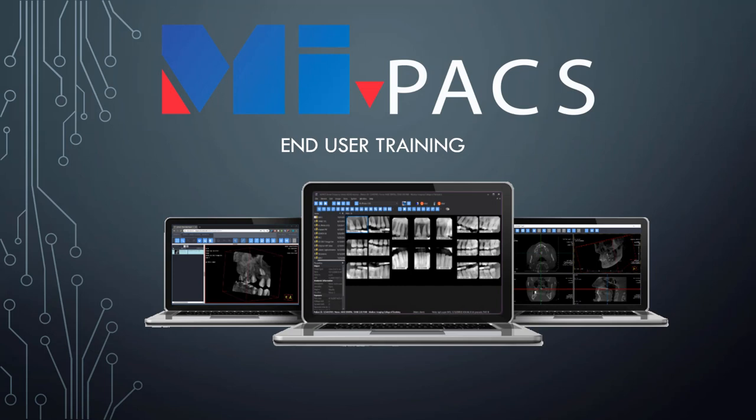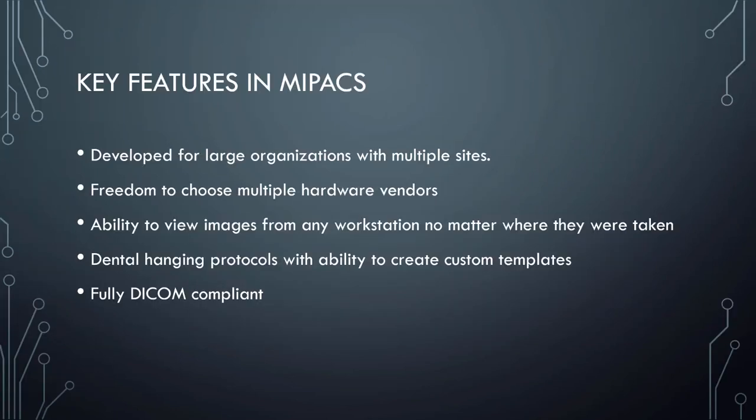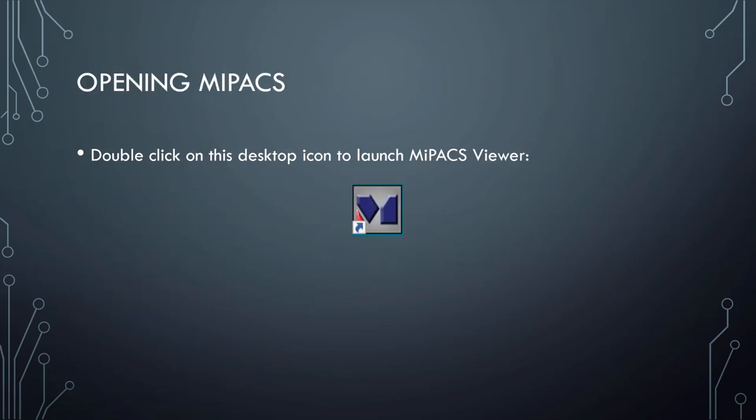Welcome to the MiPACS Dental Enterprise Viewer End User Training. The MiPACS software suite boasts feature flexibility to complement the industry standard DICOM client server model. To launch the MiPACS Viewer, double-click this icon on your desktop.